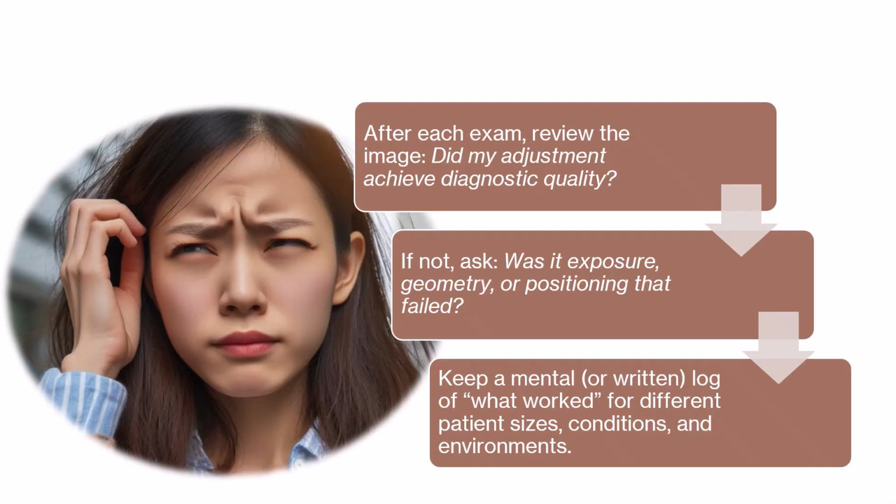After each exam, review the image. Did my adjustment achieve diagnostic quality? If not, was it the exposure, geometry, or positioning that failed? And keep a mental or written log of what worked for different patient sizes, conditions, and environments.